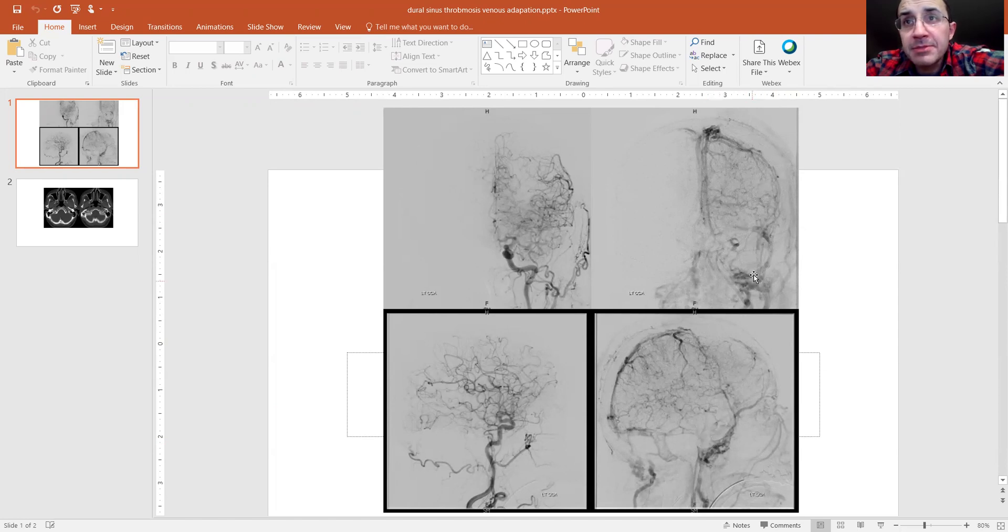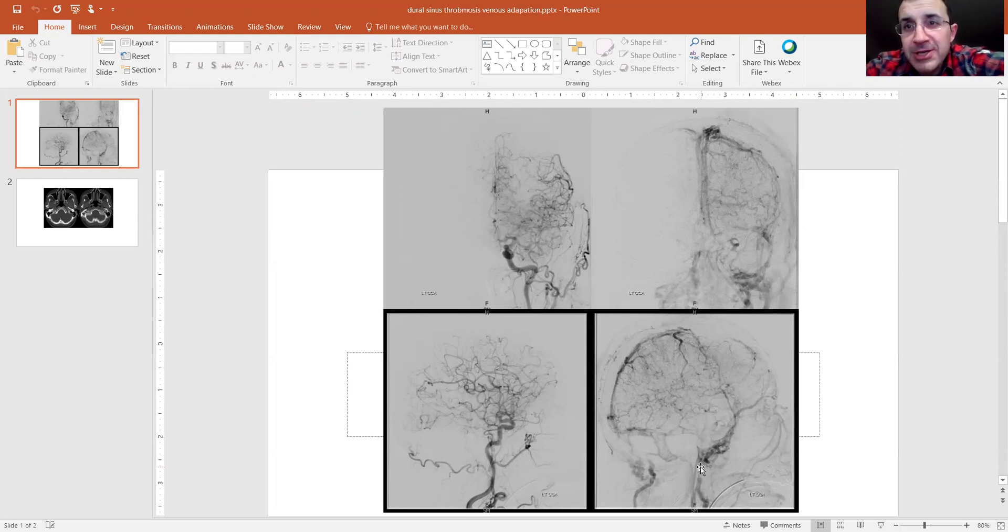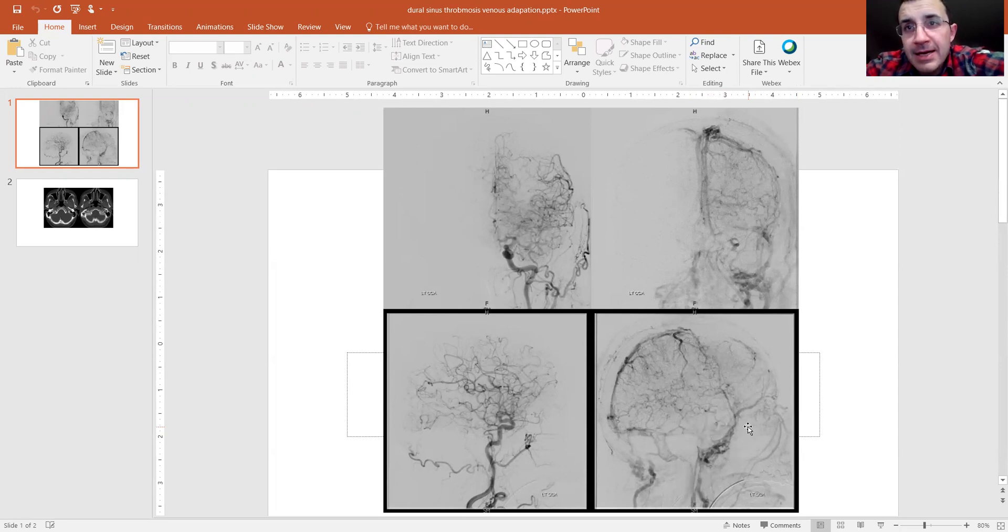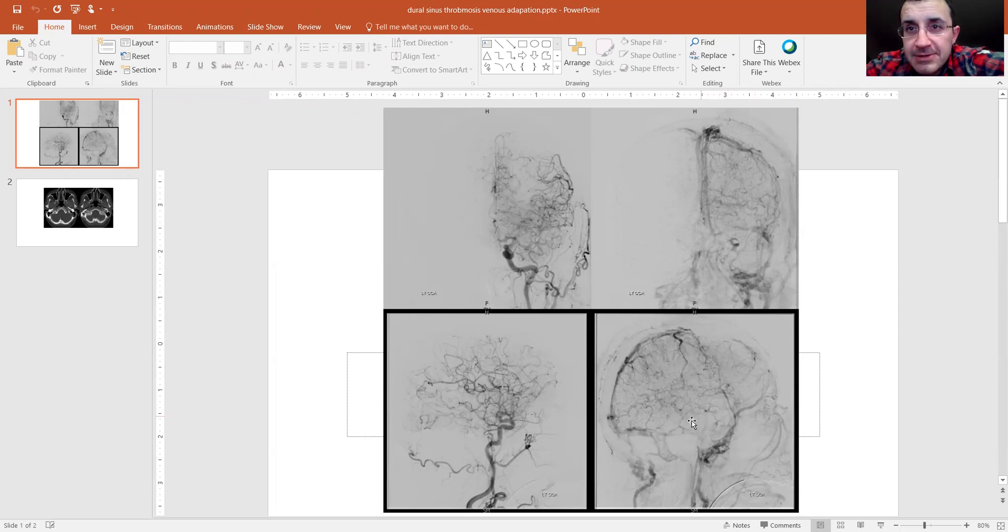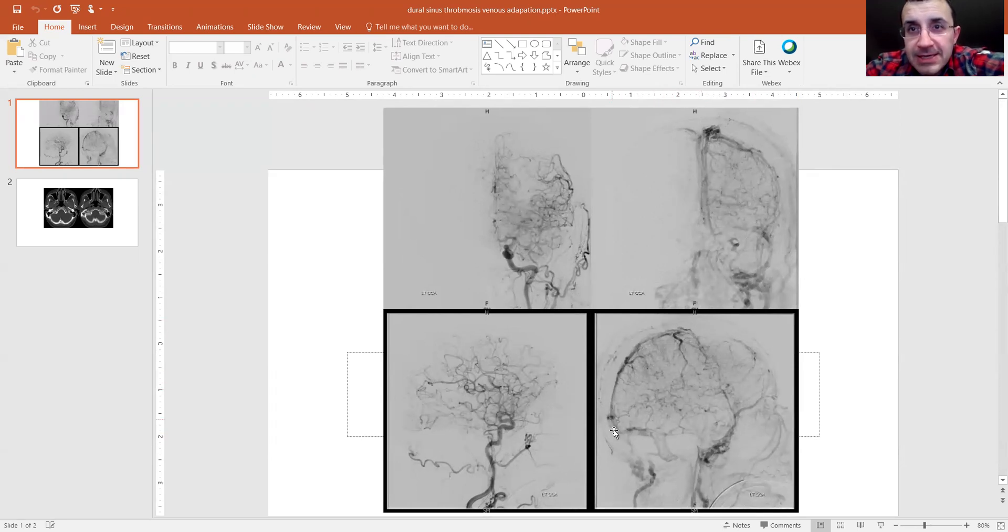And they'll be draining via another channel. We don't have to talk about that right now, but it's also some important stuff, another diploic channel. And they're going down into the pterygoid palatine venous plexus. The rest of the hemisphere is a little bit congested. But again, things are finding their way. You see how all these little veins are going down into the sigmoid sinus. There's some stuff open that's coming up into the superior sagittal sinus. And then again, coming into these veins here.